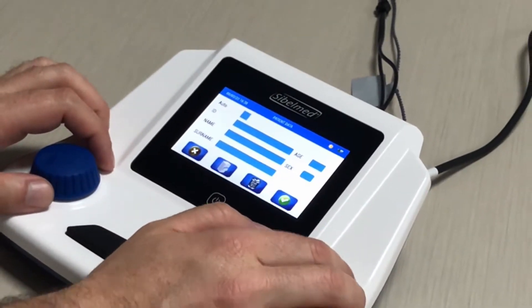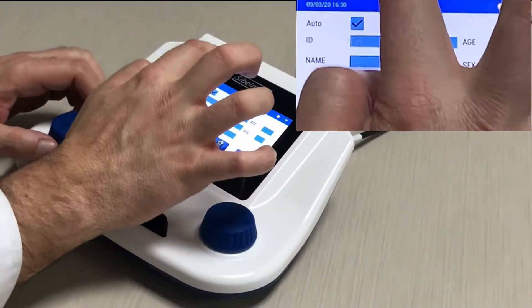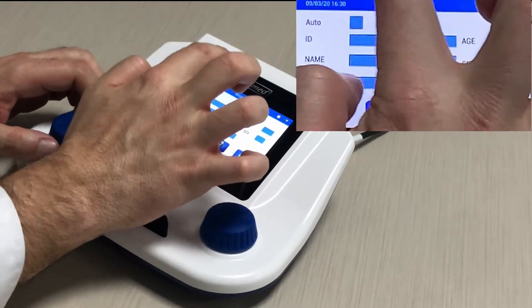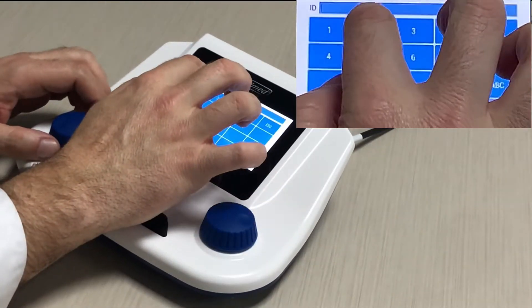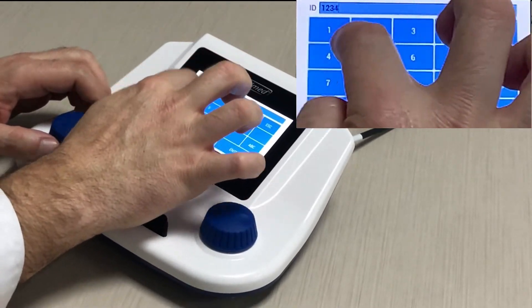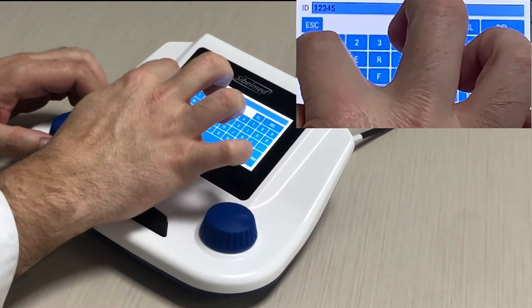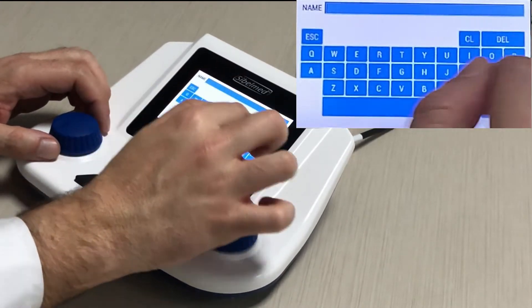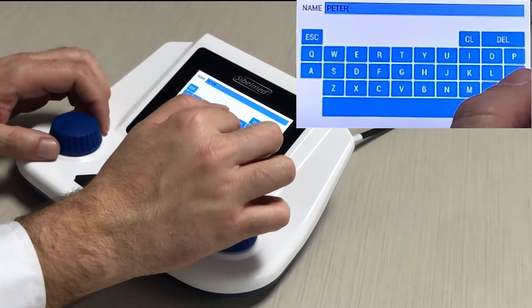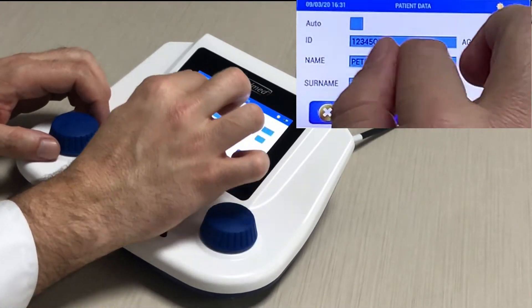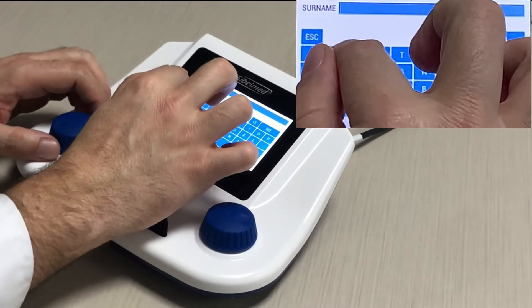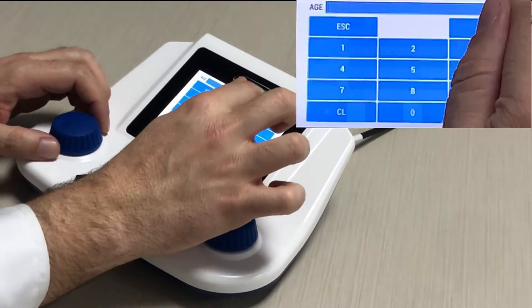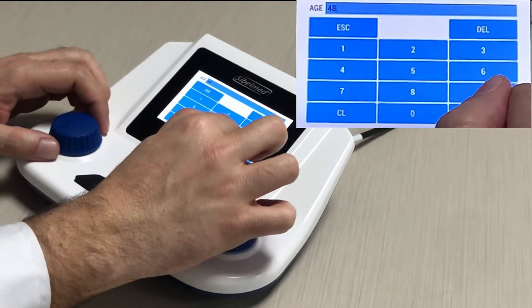Press the new patient icon. There is an option to automatically generate the ID, or we can introduce a numeric or alphanumeric reference — for instance, the patient number from his records. Input the name and surname; the device will allow you to introduce the age and gender.